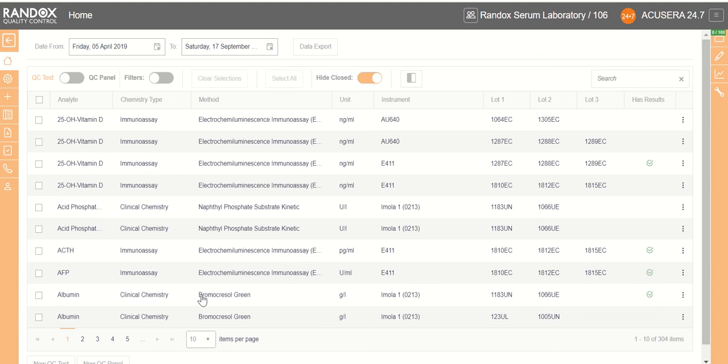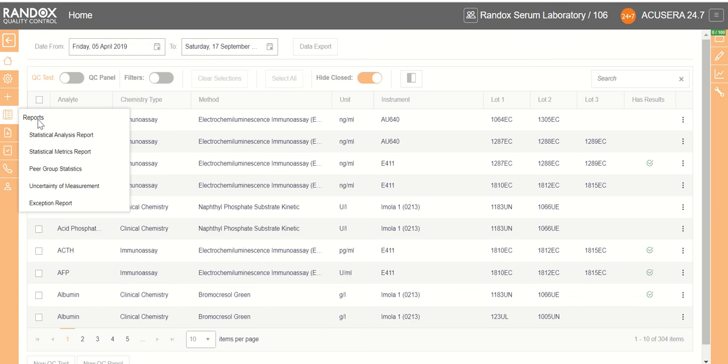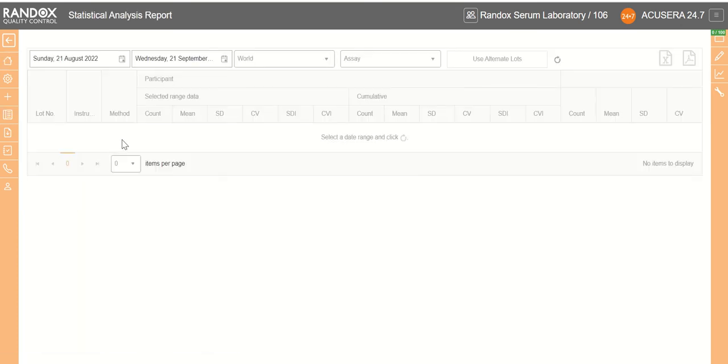In this part, we're going to be looking at the statistical analysis reports and reports in general. So we're beginning on the home page on Acusera 24/7, and if we go to our left-hand side, we find our reports tab. Underneath this, we have the option of 5 different reports, namely the statistical analysis report, statistical metrics, peer group statistics, uncertainty measurement, and the exception report. So we're going to take a look at the statistical analysis report today.